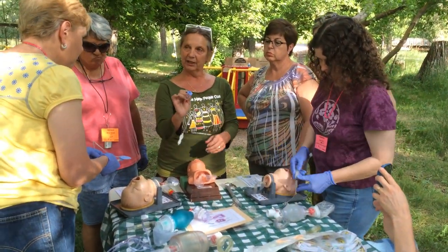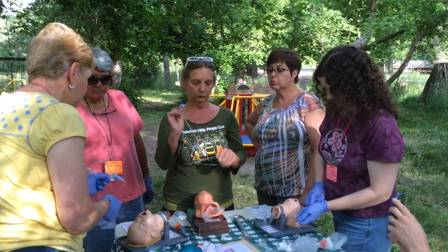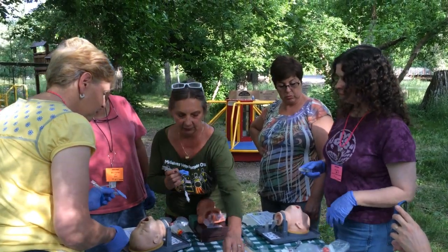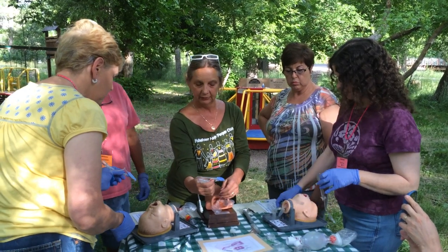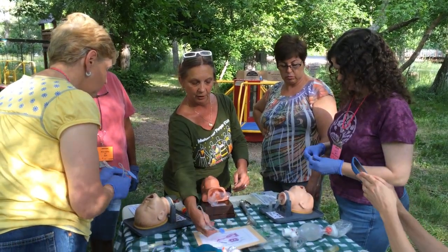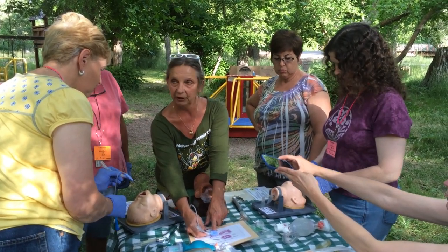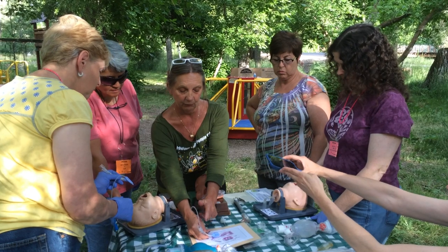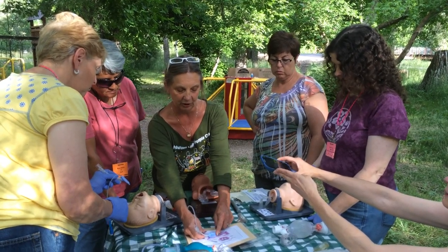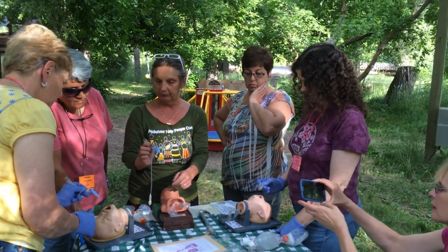You'll hold your LMA like a pencil in your dominant hand. The goal is to insert this into the baby's airway in the shape of the airway. Your goal is to close off the esophagus and to force air into the baby's trachea only, as you would with an ET tube.